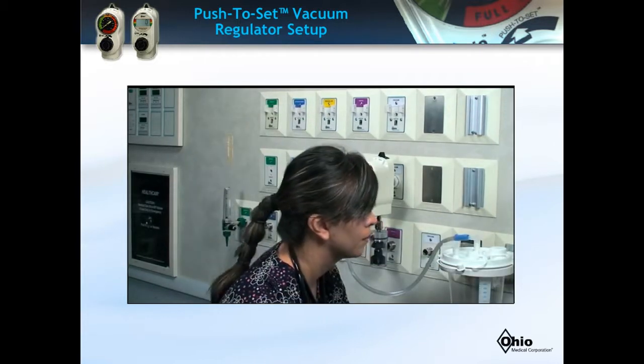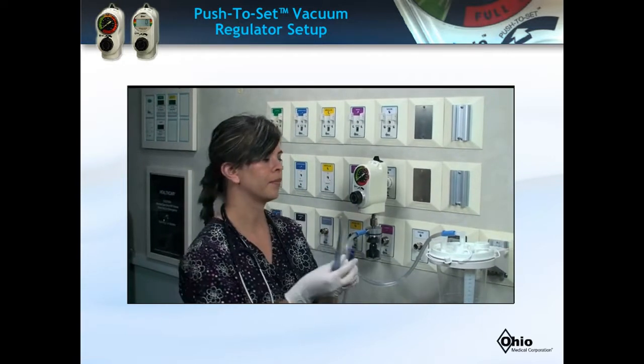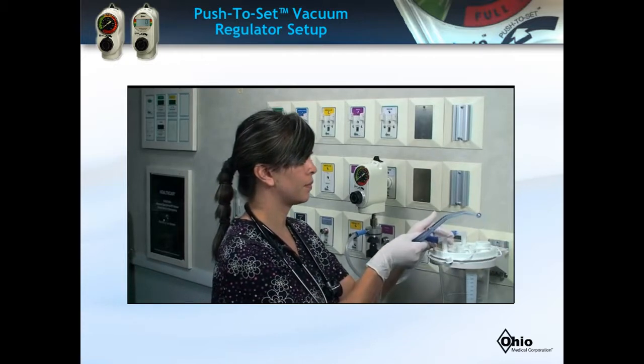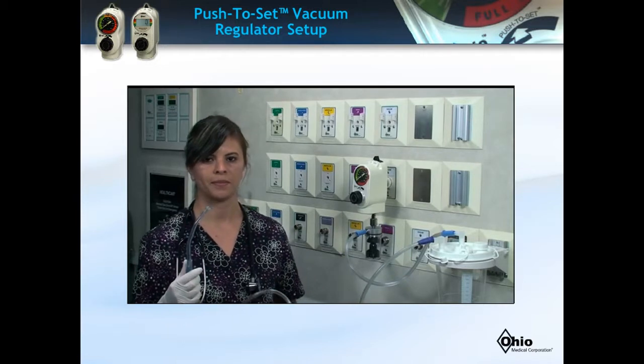Also, the proximal patient tubing, recommended at 72-inch in length by 1/4-inch diameter, is connected to the top of the suction canister patient port. Take care that the patient tubing is mid-line to the patient and does not loop below.